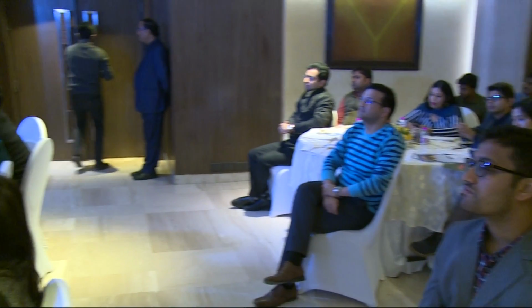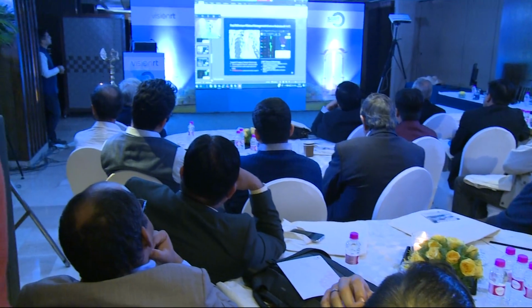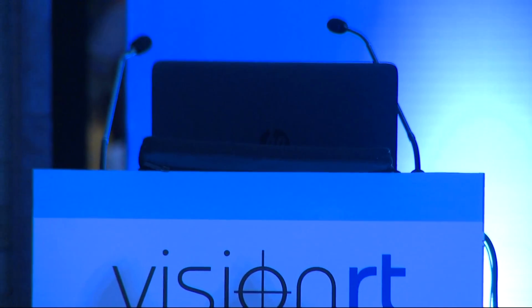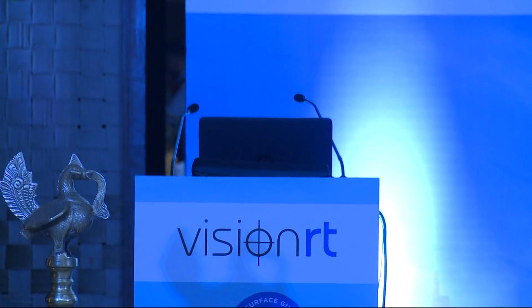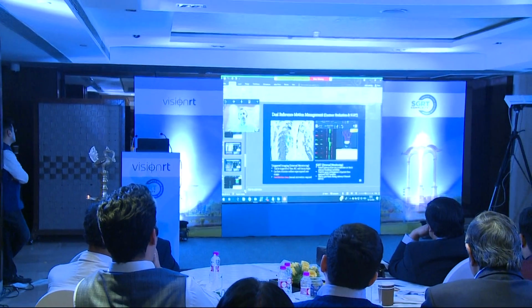This is something that you can do with SGRT that you can't really do with other things. We've aligned this patient with a cone beam CT on slide 22. On the right-hand side, we take what's called a gated capture. So we take a capture of the patient during the breath cycle, so you can see the full breath cycle, and you pick a mid-phase for that cycle. We use a 2 millimeter gating window for our SBRTs, so we set the tolerances to 2 millimeter on that gated capture and turn on gating, and we do what we call set it and forget it.